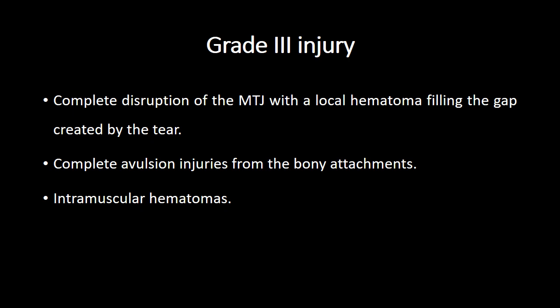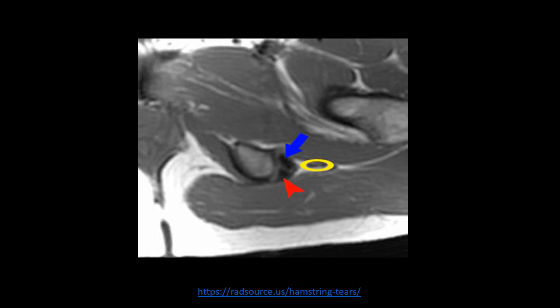Grade 3 injuries represent complete disruption of the myotendinous junction with local hematoma formation, or there can be complete avulsion of muscles from their bony attachment sites. Let us see an example of a grade 3 injury at the ischial tuberosity. For that, let us first revise the normal anatomy in this region.